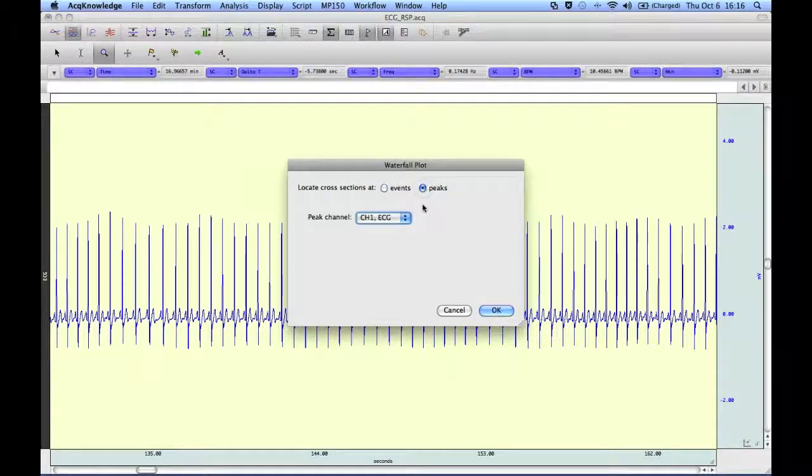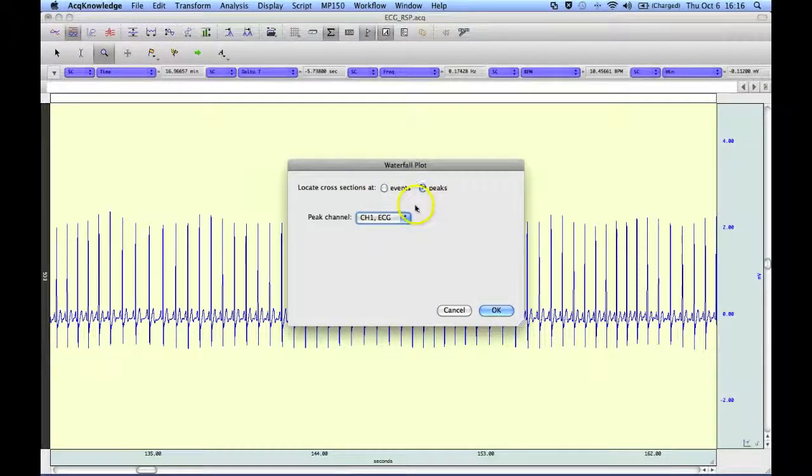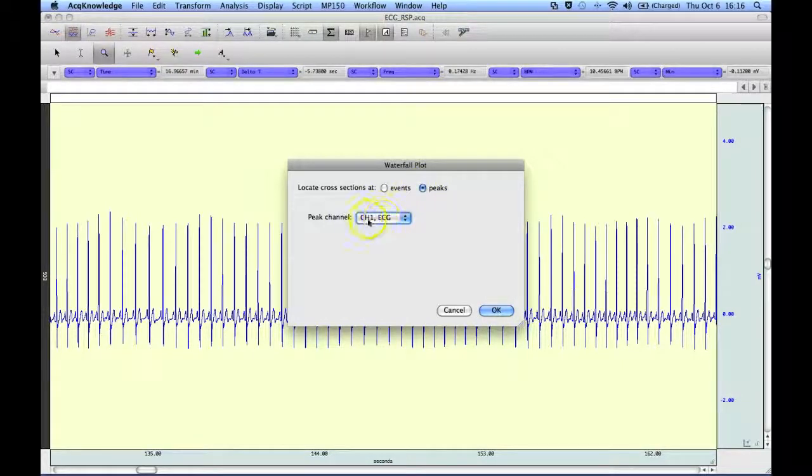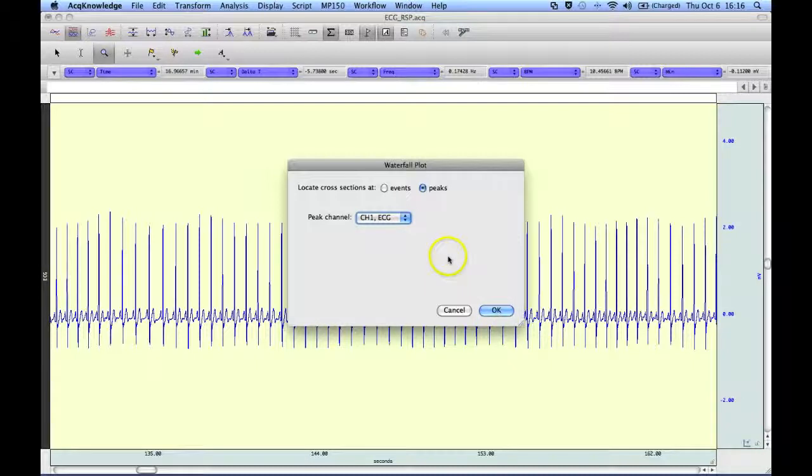or off of peaks, and as I said previously I'm going to use the peak of this ECG signal for creation of the plot.